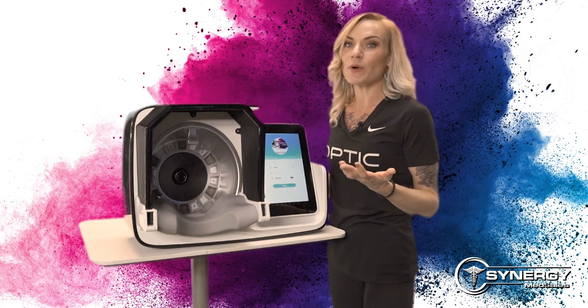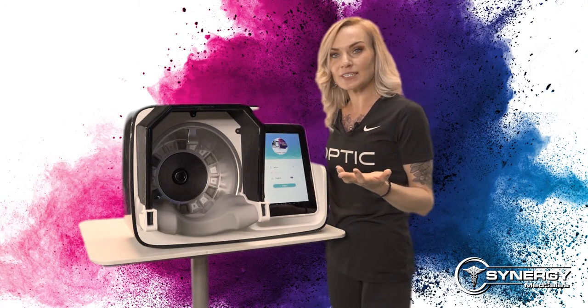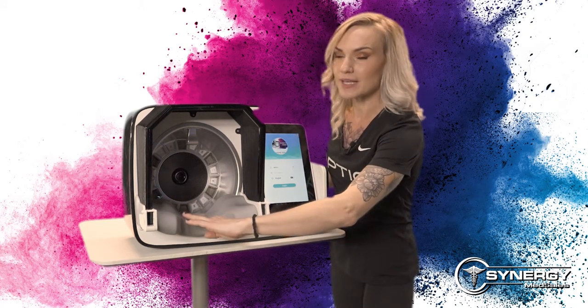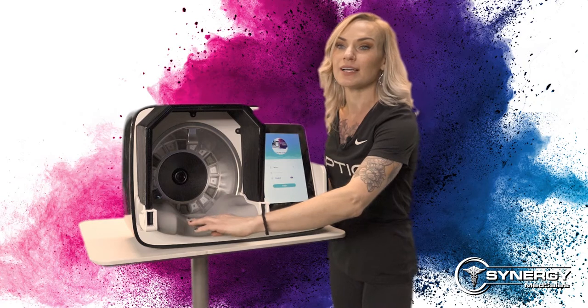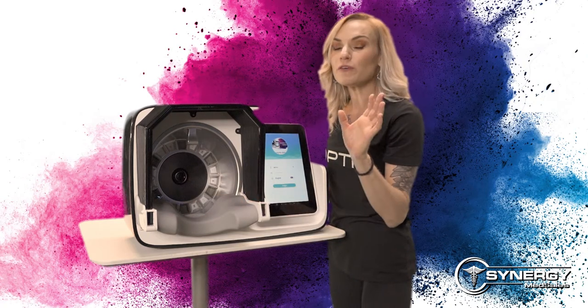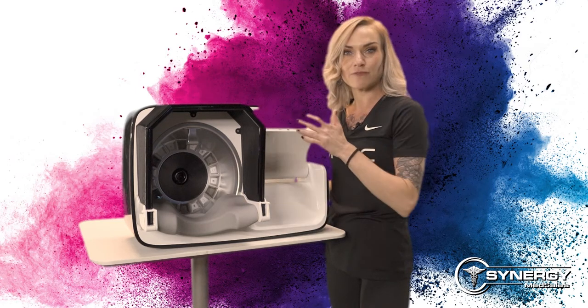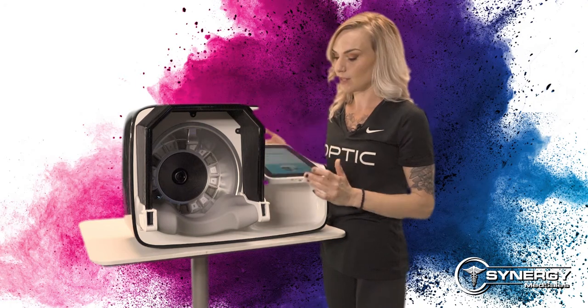Again, your Optic is going to scan for 10 different skin conditions. Your patient's face will go here into the camera module, chin rest against here, close their eyes, and the Optic will scan. All of your information will be input in this touchscreen tablet that's attached to the system. It swivels back and forth for your comfort.